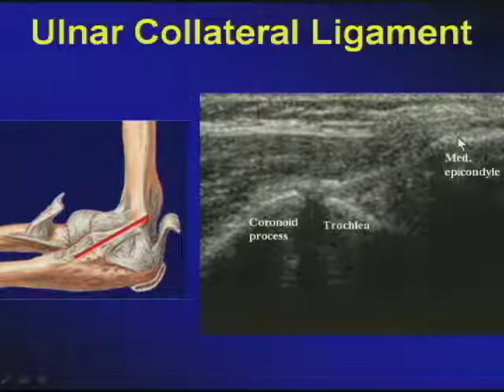And if you connect the apex of the epitrochlea to the sublime tubercle of the coronoid process, you get to see with a bit of anisotropy the ulnar collateral ligament. A heel-toe maneuver would have helped us to do this in order to look at the more compact or packed fibrillar pattern of the ulnar collateral ligament. Note that we are a little bit more posterior than the conjoined tendon of the common insertion for the flexor tendon, so we see only a part of the tendon and mostly the multi-pennate structure of the different muscles.